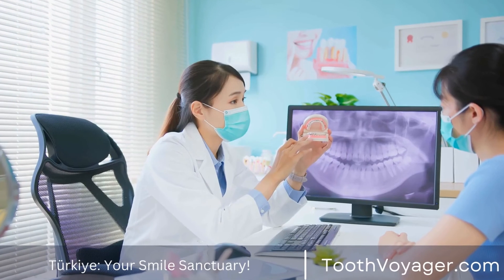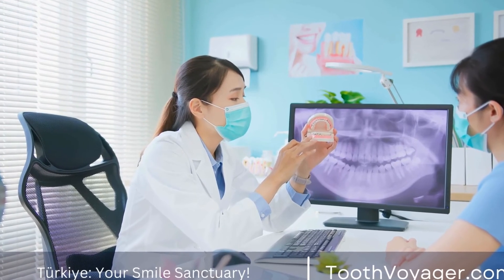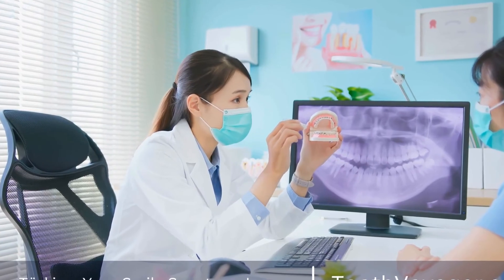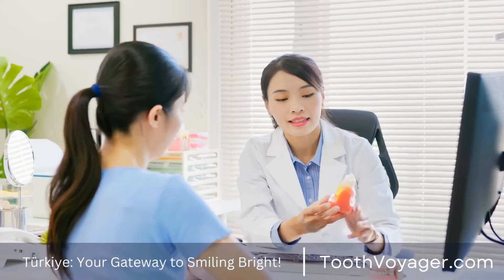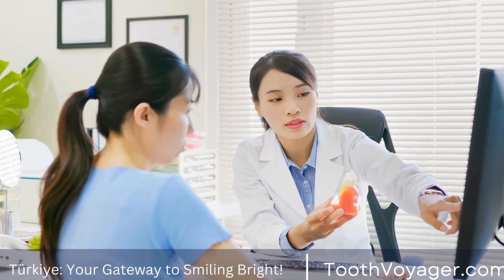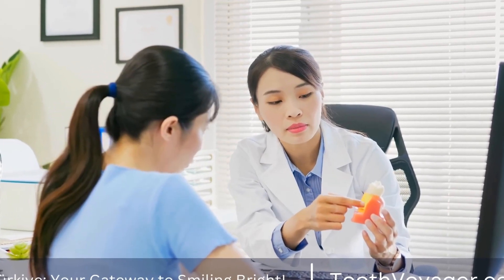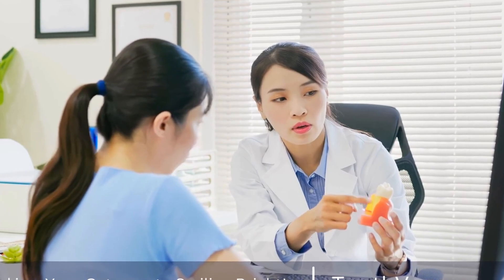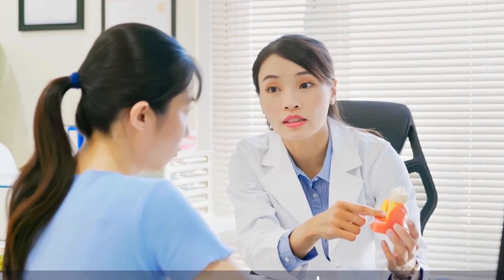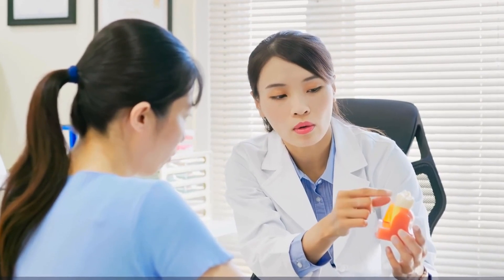Root canal treatment is a highly effective procedure for saving a tooth that has become infected or decayed. By following the step-by-step process outlined in this video, you can understand how root canal treatment saves your tooth and why it is important to seek treatment if you are experiencing tooth pain or infection.